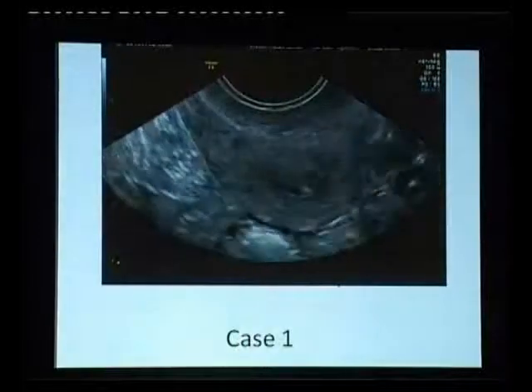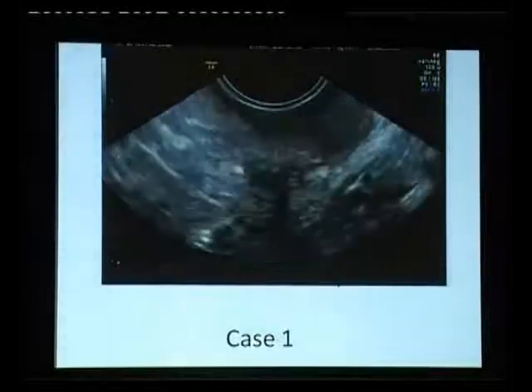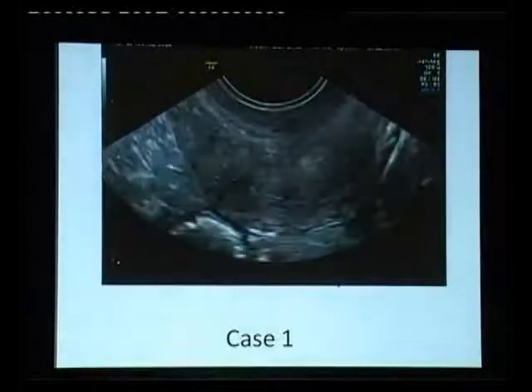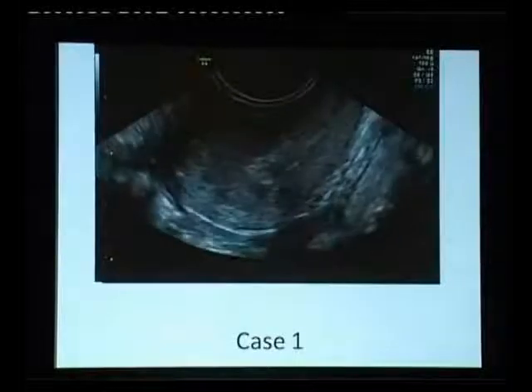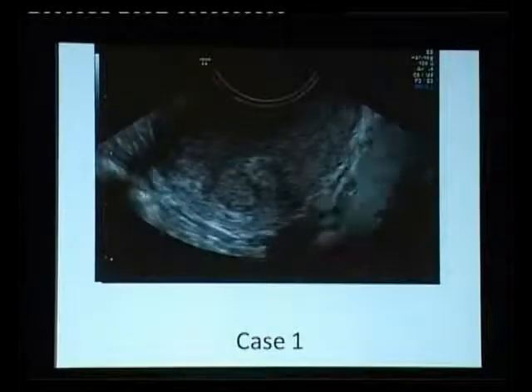We take a new clip. Now we are in the transversal section. We're sliding down slowly. Can you see any disruption of the pericervical fascia? No? And then we take another image. And you can also see how I am pushing here to see if it's moving. I'm pushing to see if it's sliding. It seems to be sliding freely.